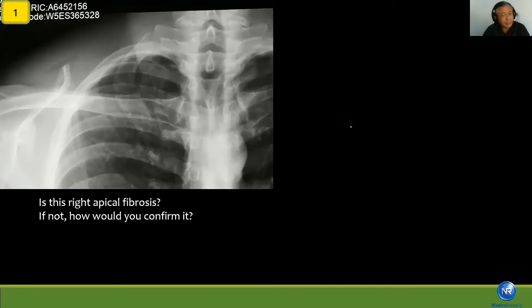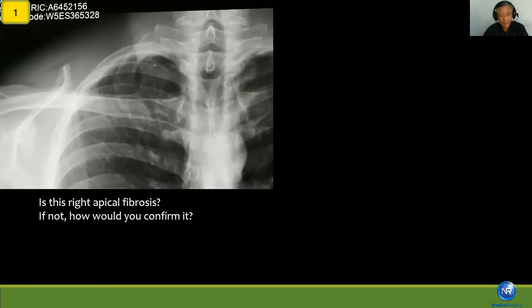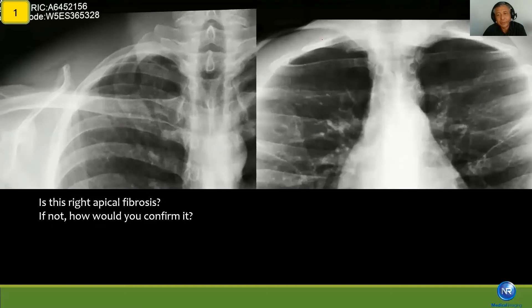Look at this particular X-ray — is this apical fibrosis? There is a linear shadow in the right apex, yes. But follow the shadow: it goes all the way up to the lower neck, and lower down it goes along the clavicle. So this is actually soft tissue shadow at the lower neck — more exactly, this is the sternocleidomastoid shadow. To confirm it, an apical view is done, and there is nothing in the lung field. So this confirms that the shadow is not in the lung.